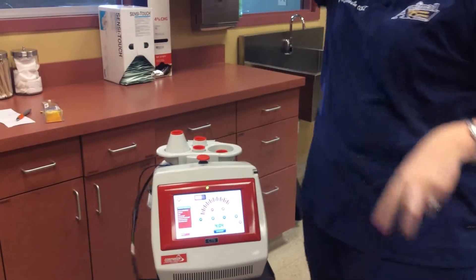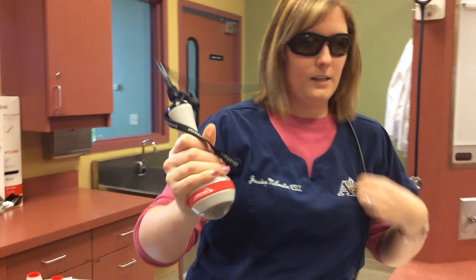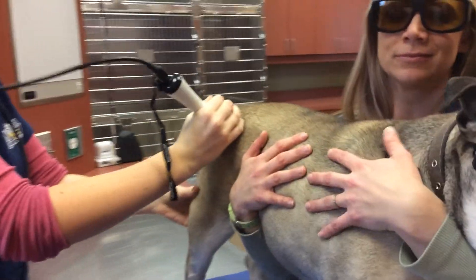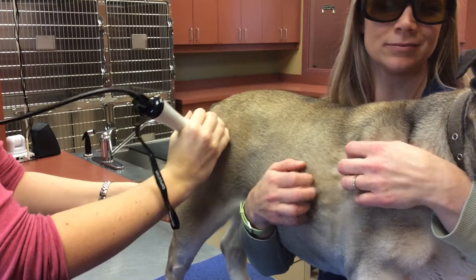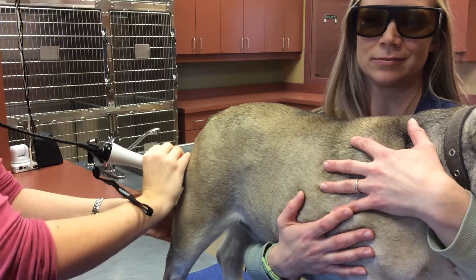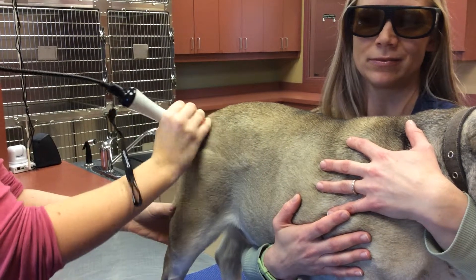And then grab your handpiece. The handpiece is what emits the light that helps with the laser. You're going to start and move in a nice, slow pace in a group pattern to make sure you cover the entire area that you need to cover.